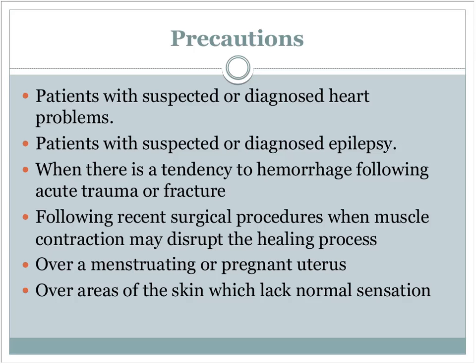Skin which lacks normal sensation. You'll see that one a couple of times. You need to be aware of it. Take a look, maybe after 5 minutes of running the treatment, turn it off, look underneath the electrodes. Is it causing irritation that, because they have diabetic neuropathy, they didn't feel, and so they can't tell you it's a problem?